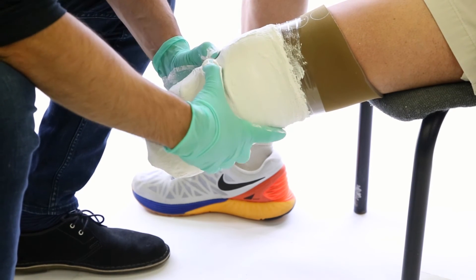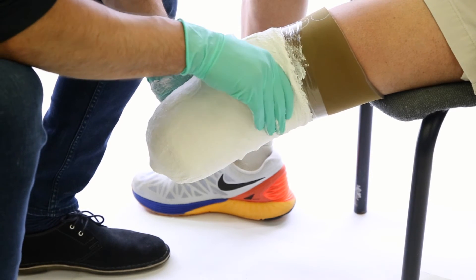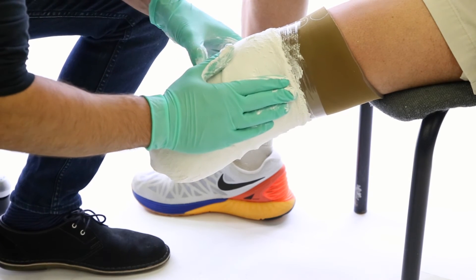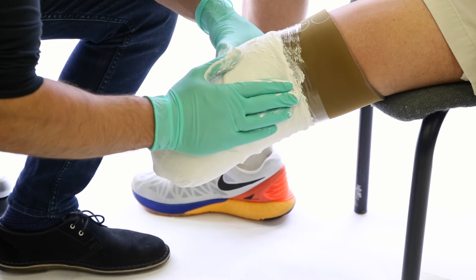Also, if you need high trim lines which go over the femoral condyles, make sure to compress on the lateral side and keep the wall flat, and compress medially to create an indentation over the medial femoral condyle.